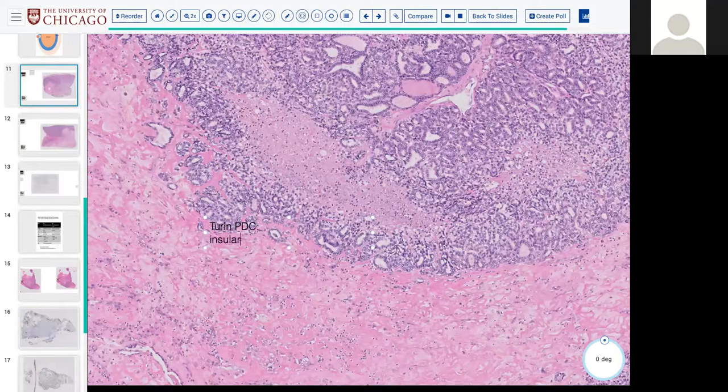Insular, as I remember, like the architecture. So yes, insular versus solid. Necrosis. Trabecular as well. I think there are three patterns. Necrosis for sure, and then how ugly it is. So necrosis or mitoses or cytology, kind of. Absence of PTC nuclei. Convoluted.